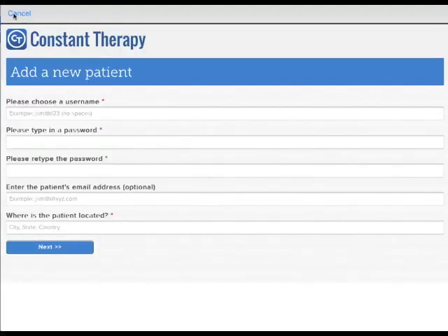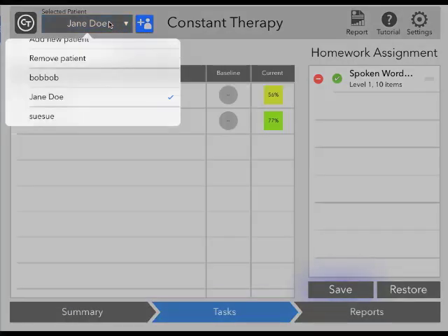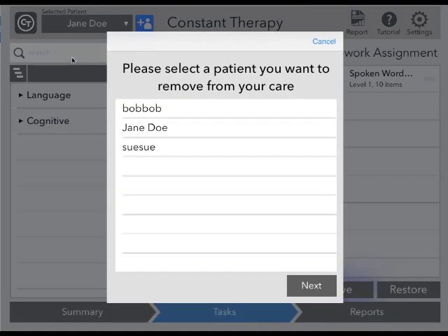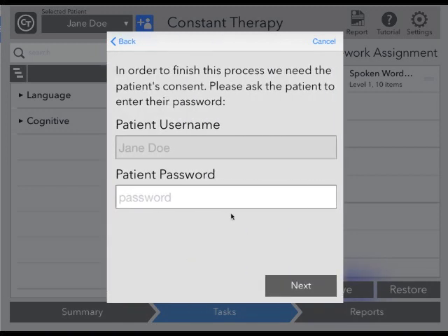Or you can select an existing patient by choosing from the drop-down menu. Here you will see all of your existing patients, and you will also have an option of removing a patient. When you choose to remove a patient, you will have the option of disabling that patient's account, or that patient could continue to use Constant Therapy after leaving your care. If you select yes, patient will continue, you will need the patient's consent to finish this process.